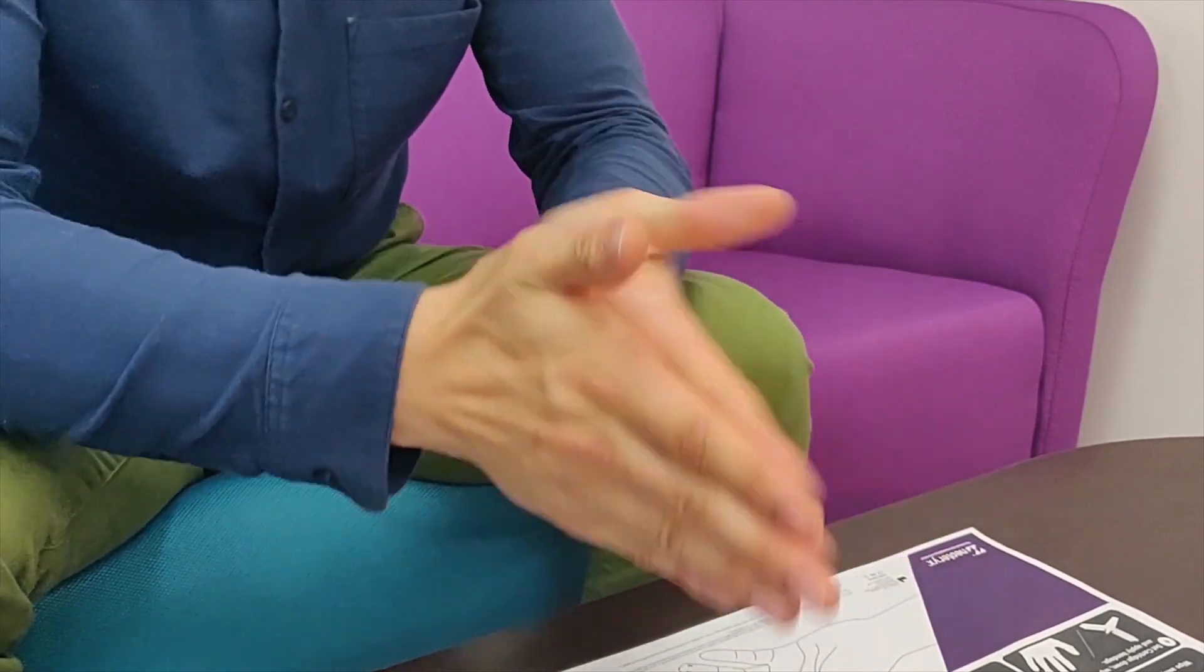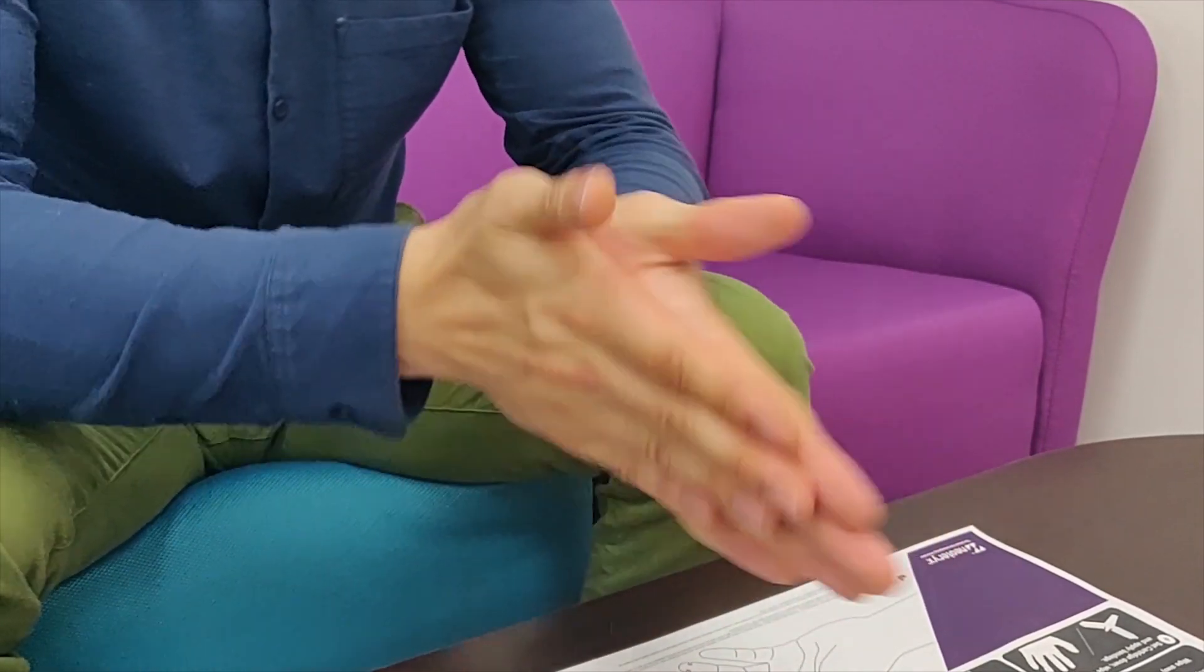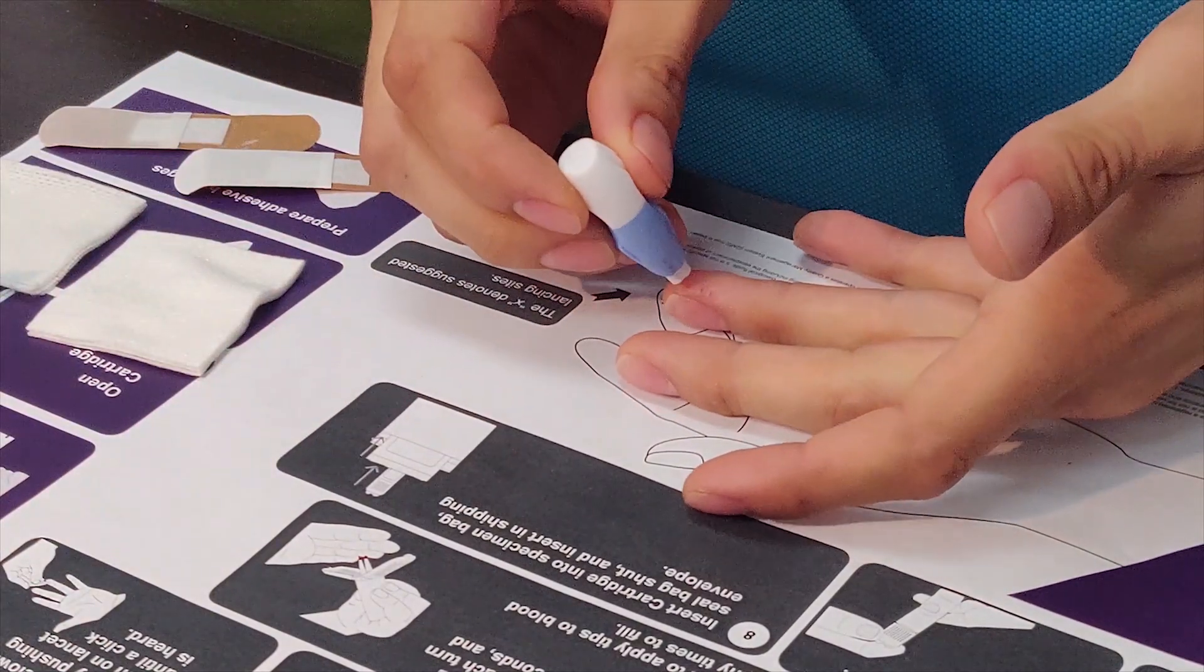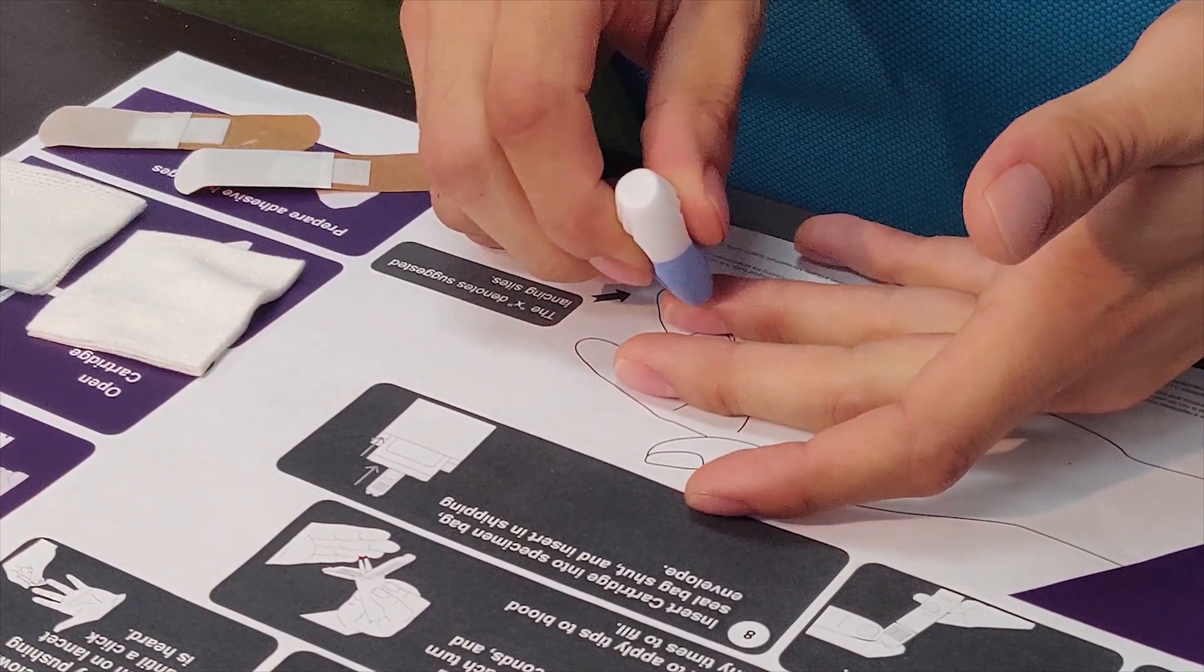Okay, let's begin. Vigorously rub your hands to warm them. Then place your hand down and position the lancet just off the center of the finger pad and push down. You'll hear a click.